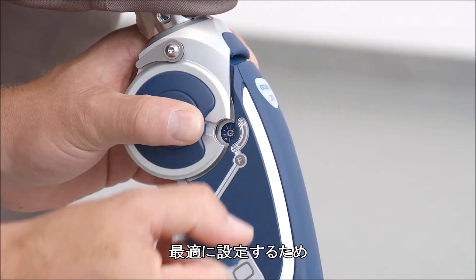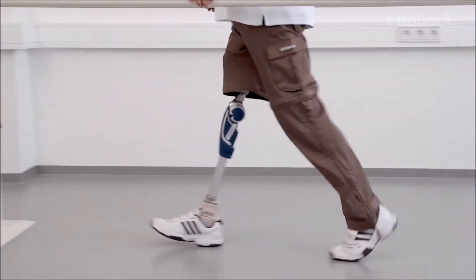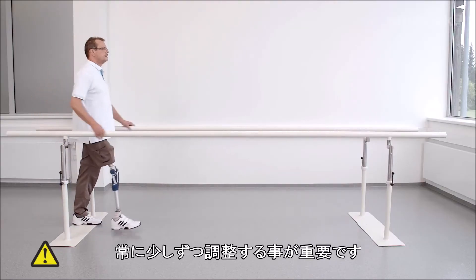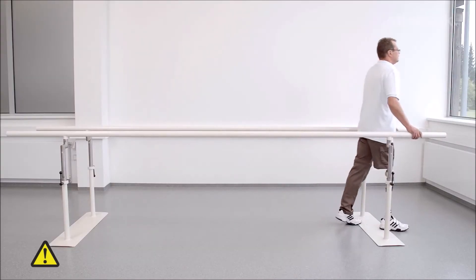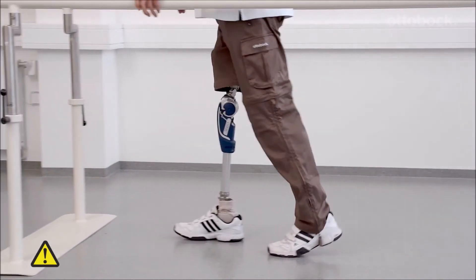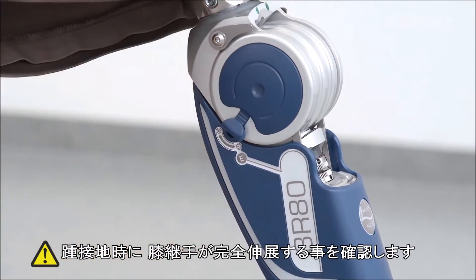In order to achieve an optimal setting, the flexion damping should be adjusted according to the user's needs. It is important to always take small steps when adjusting away from the factory setting of minimum extension damping. An extension damping set too high means that the knee joint no longer comes into full extension, which could lead to a fall. Reducing the extension damping setting ensures that the leg will reach full extension at heel strike.